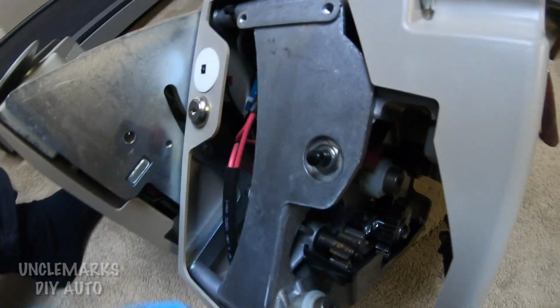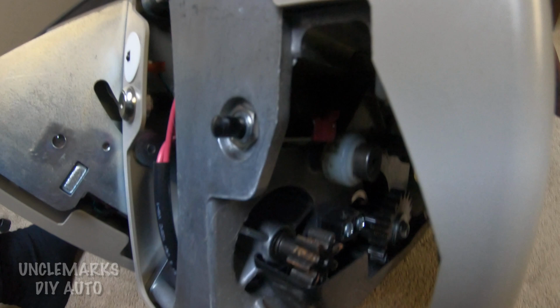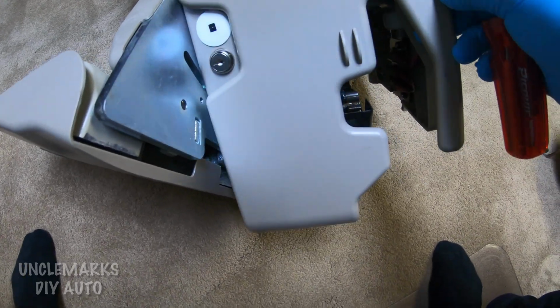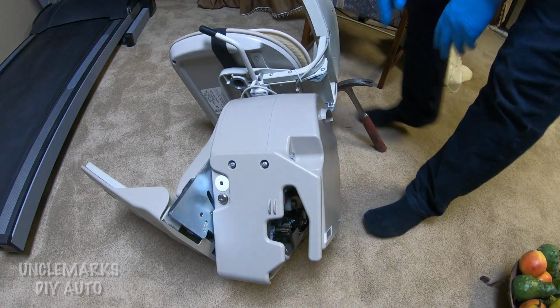But there is a switch here, I see. So maybe if this cover comes off, the switch will pop out, and then it won't move because you could get your fingers or other things caught in there. Kids could be playing and hurt themselves. So that's a safety switch, so maybe check that out, if it's working or not. I'll put those back together. It's just Phillips.